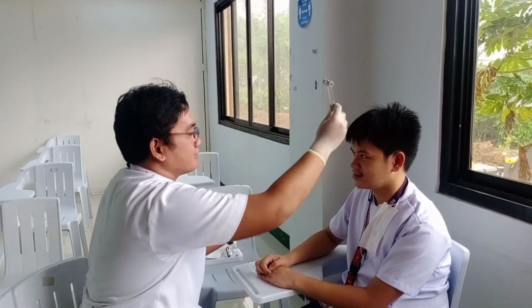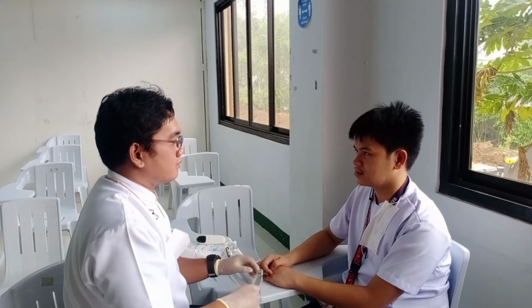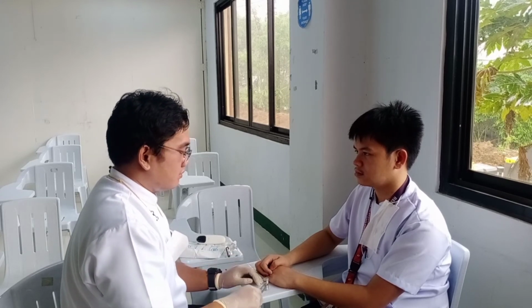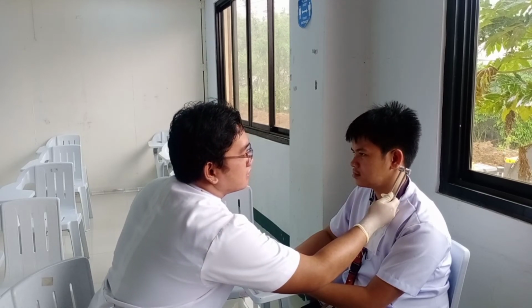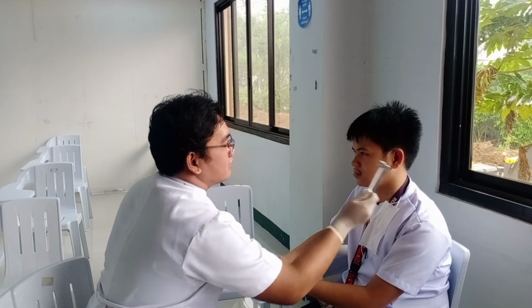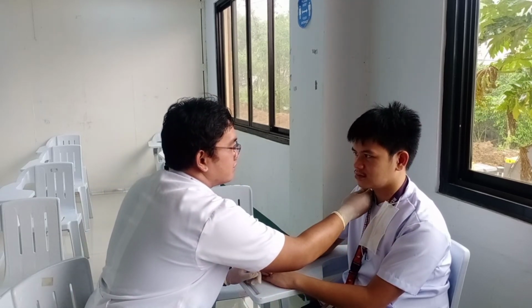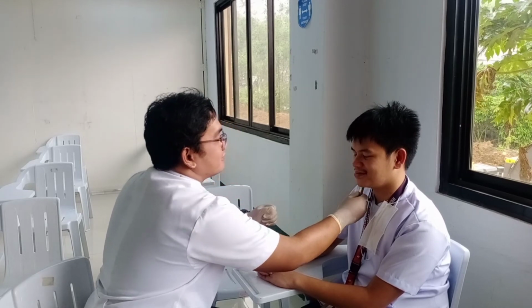For the Rinne test, strike the tuning fork on the table and while it's still vibrating, place it on the client's mastoid process. This is to compare air conduction to bone conduction. Measure the time in seconds that the client hears the vibration. This is to determine whether the result is positive or negative.